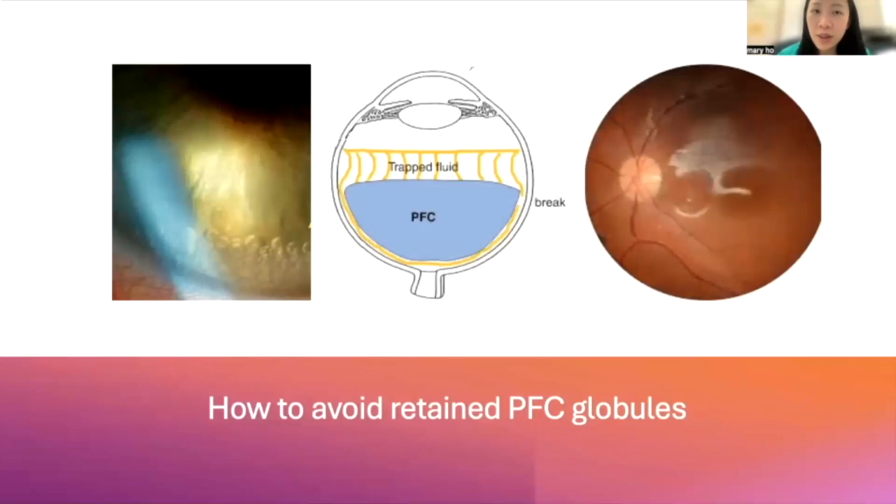And because I opened up the wound wide for a period of time, the infusion cannula kept injecting fluid, and it made a lot of turbulent flow. Despite multiple efforts in removal of the PFC globules, there was retained PFC post-op. So during the second operation, how can I make sure that all of the small PFC globules are removed? I injected the VisionBlue so that the small globules of the PFC stay visible. In fact, there are multiple globules for complete removal.